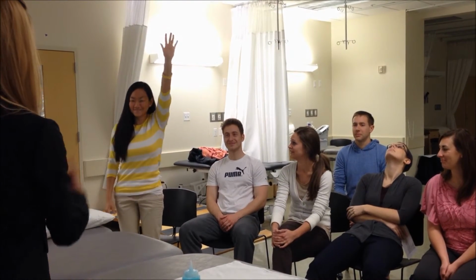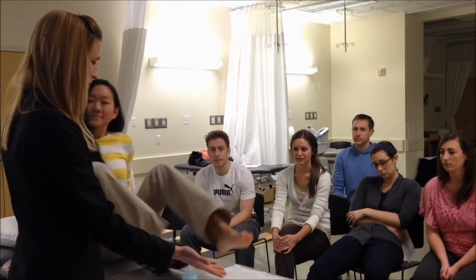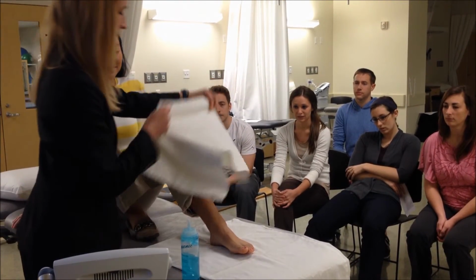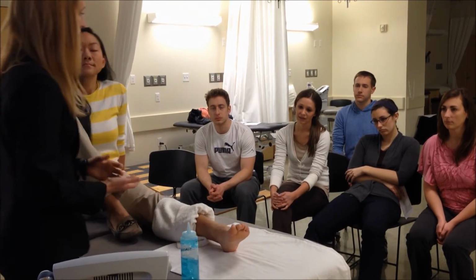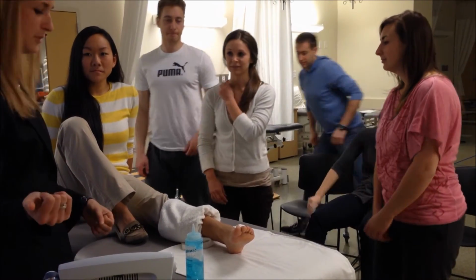We're going to move into the demonstration portion. Can I get a volunteer, please? Me. All right, come, please. Hop right up. We're going to do your anterior talofibular ligament, so please put it on the pillowcase here. We'll roll up your pants and put a towel around. All right, go ahead and relax that leg down. Okay, and come gather around because I'm going to show you guys how to use your new ultrasound machine.